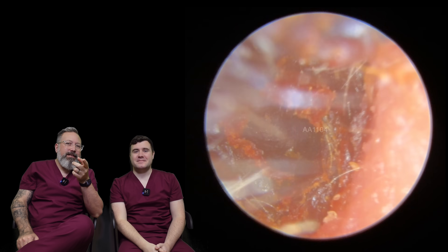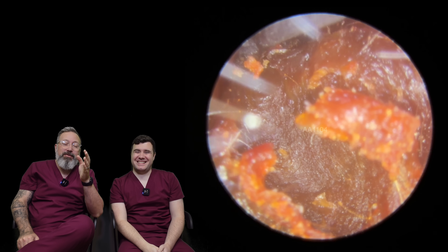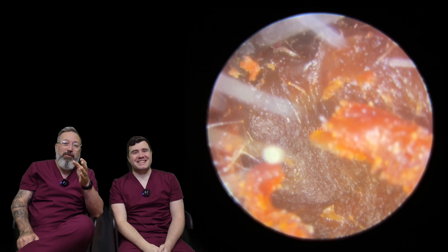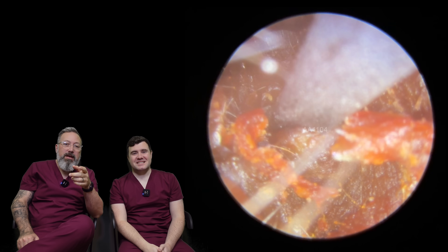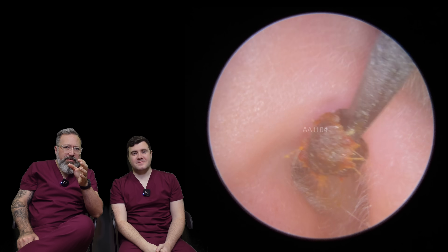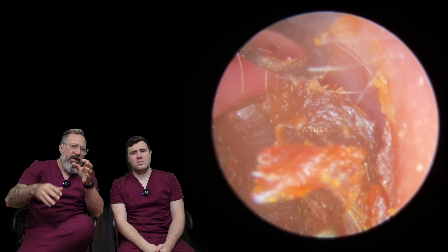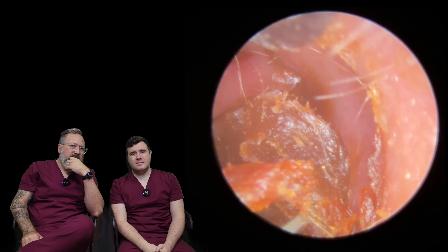Usually this is one of Neil's tools. Every time I do this I think I'm going to have to remember the name of this tool — I never look it up before the next lot of voiceovers. But basically this is like Neil's version of a Jobson horn. And I'm just taking the front section over here. I was hoping I was going to get above it and pull the whole thing. We've got this kind of peel on the one side.